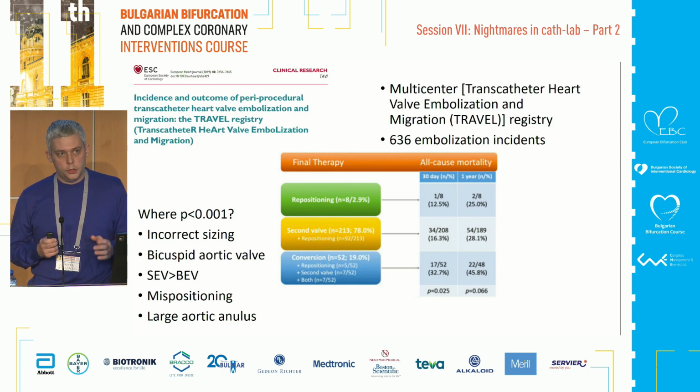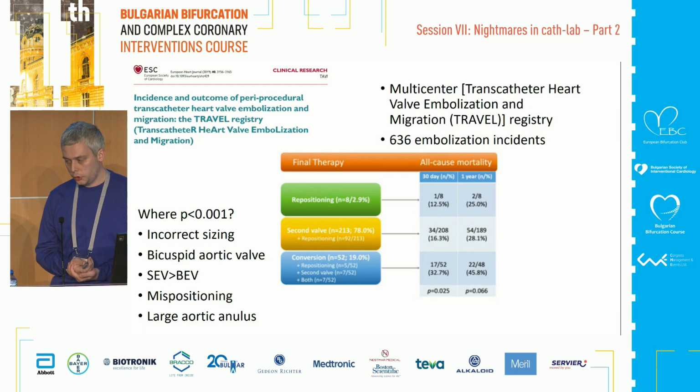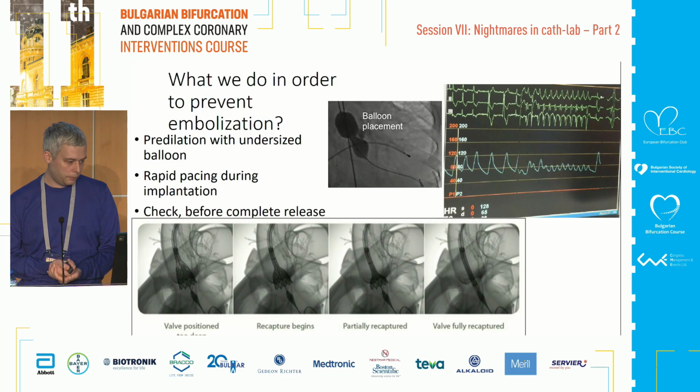The authors also discussed three treatment methods in case of embolization. First is conversion to open surgery, then implantation of a second valve, valve-in-valve, and an attempt to reposition the malpositioned valve.